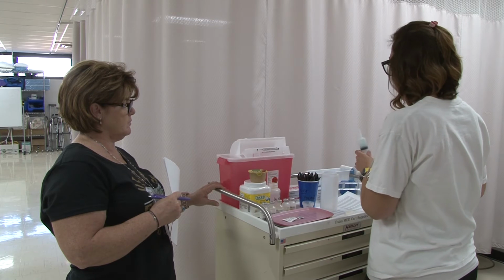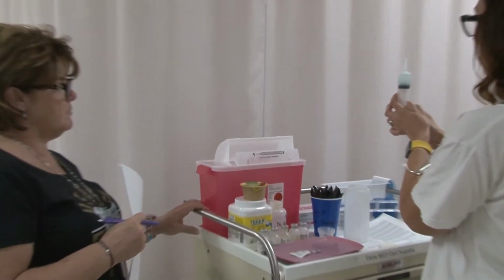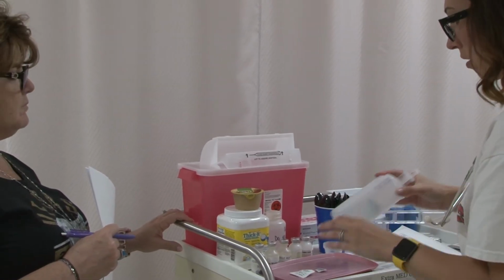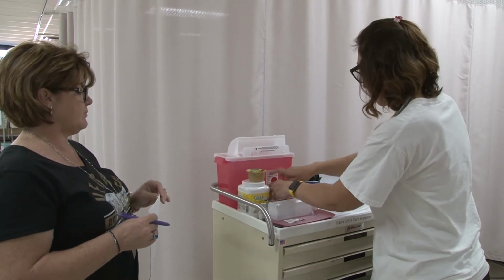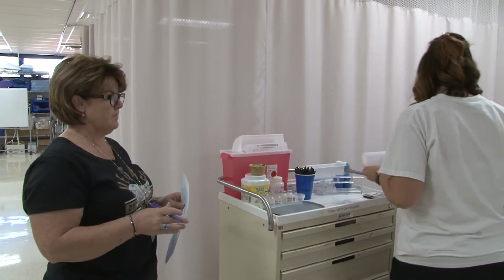That's going to go in the trash. This I'm going to just expel the air a little bit and put it in my bucket, bring it into my patient's room. Okay, I have my 2 medications prepared, and I'm going to grab my MAR, and I'm going to go into my patient's room.